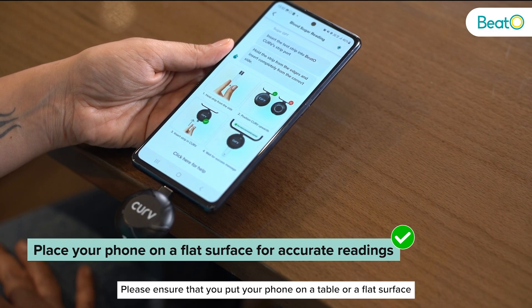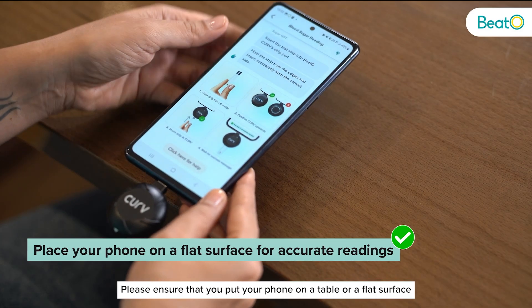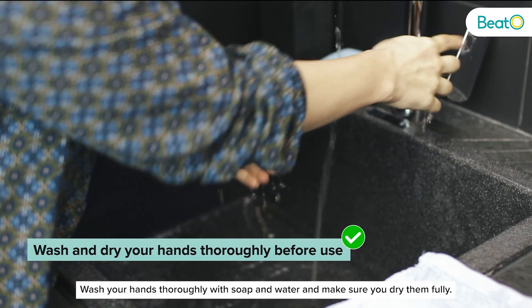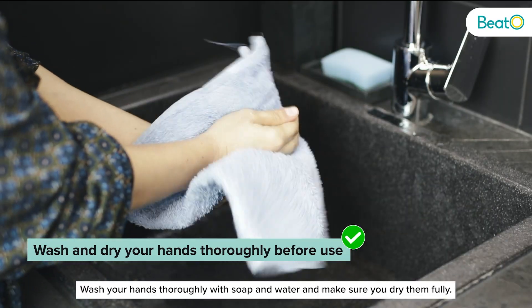Please ensure that you put your phone on a table or a flat surface while monitoring to avoid any unnecessary movement. Wash your hands thoroughly with soap and water and make sure you dry them fully.